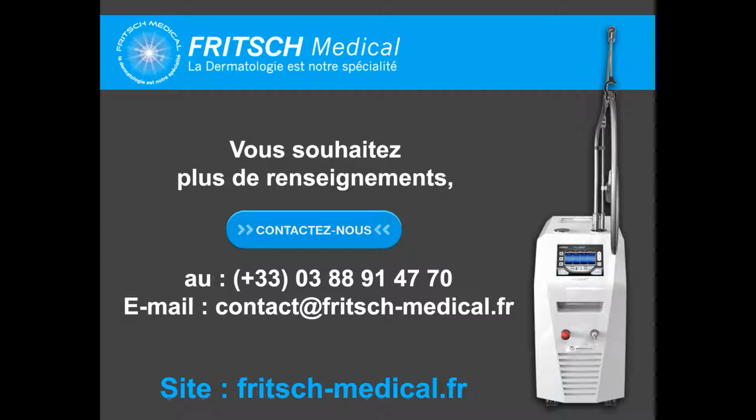I combine all in the same session, but you know, where I live in Europe is also a white skin, phototype 1, 2, 3, but it could be different where you are. If you are in South America, if you are in Asia, be careful with the sun. Also, you have to make the right choice to be sure that you don't induce some pigmentation after that, hyperpigmentation. Is this clear?